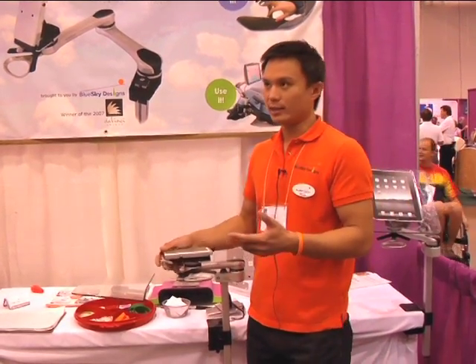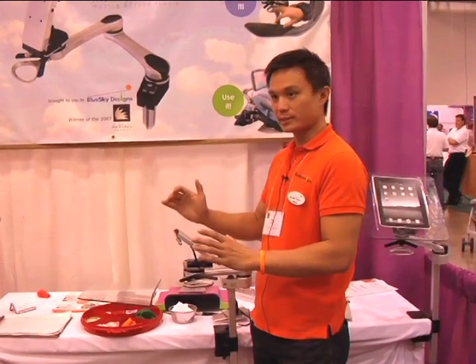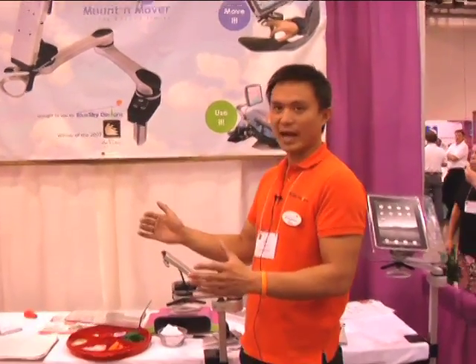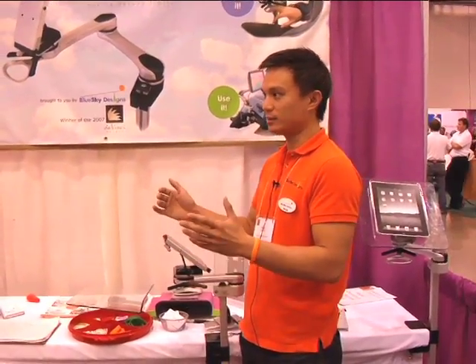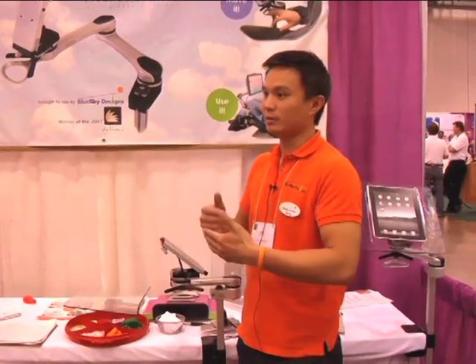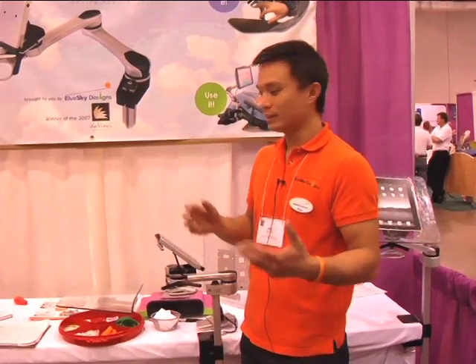Imagine if you had a communication device where this was the position that is best for access. The problem with that is it's also blocking half your field of vision, and in a lot of cases with other wheelchair mounts out there you'll be constrained and can't really pull up to tables. Or if you previously could transfer independently, now you're stuck.